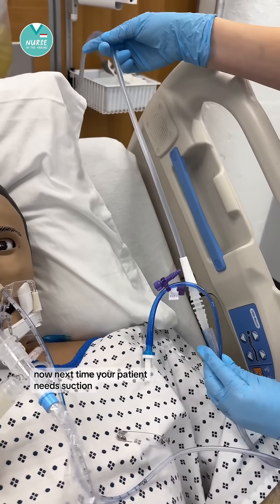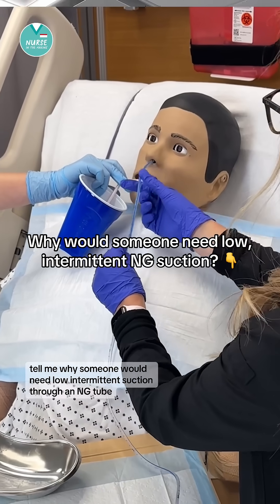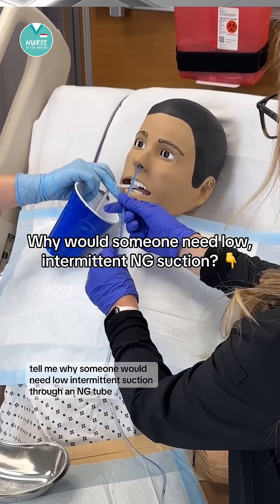Now next time your patient needs suction, you'll know what settings to use. In the comments, tell me why someone would need low intermittent suction through an NG tube.